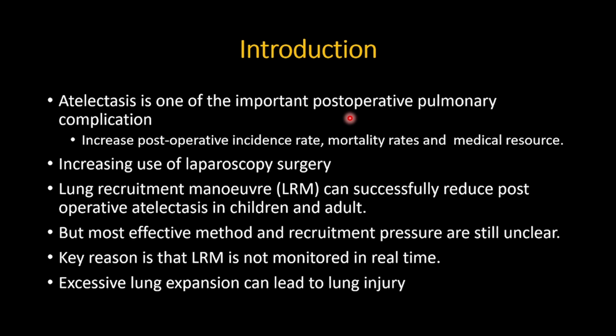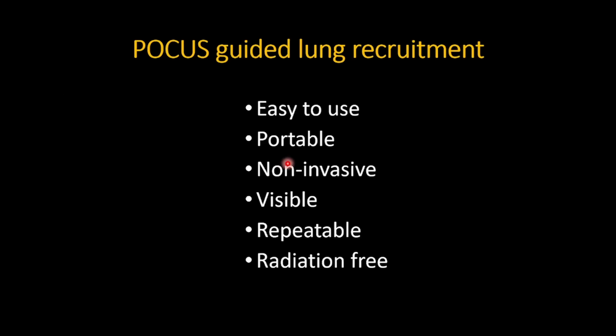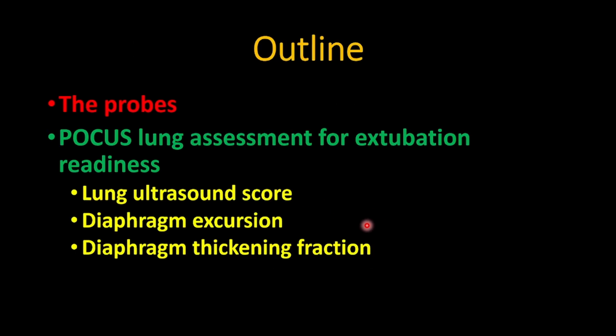Lung recruitment maneuver can successfully reduce post-operative atelectasis in children and adults, but the most effective method and recruitment pressure are still unclear, because the key reason is that this lung recruitment maneuver is not monitored in real time. And excessive lung expansion can lead to lung injury. Hence, today we're going to discuss point-of-care ultrasound in lung recruitment, which is easy to use, portable, non-invasive, lets you see the changes by yourself, is repeatable, and is radiation free.